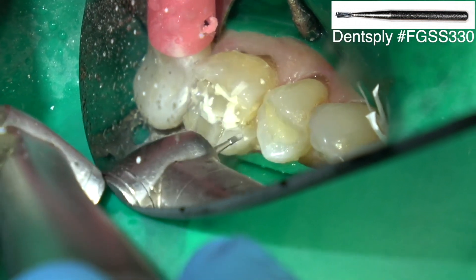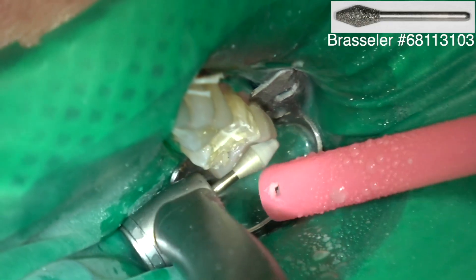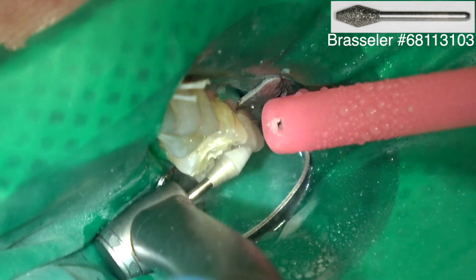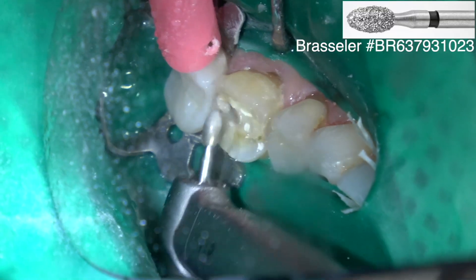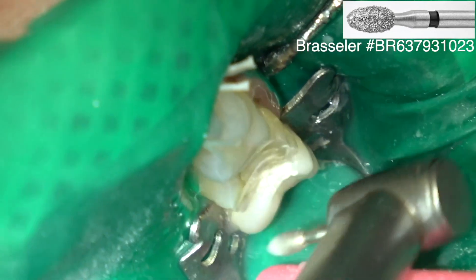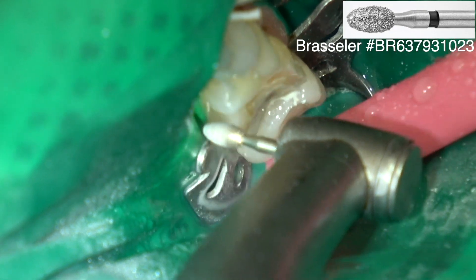So this is a 330 carbide burr and I use that as a depth cut guide. Then this is an occlusal reduction burr — I don't have to wonder about how deep or how much occlusal surface to remove because I have the depth cuts on the teeth and I just prep to the bottom of the depth cut. This is a coarse football diamond.